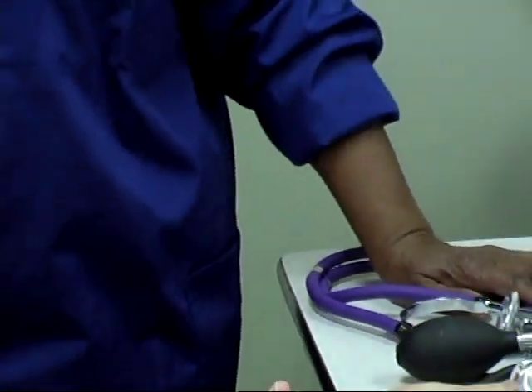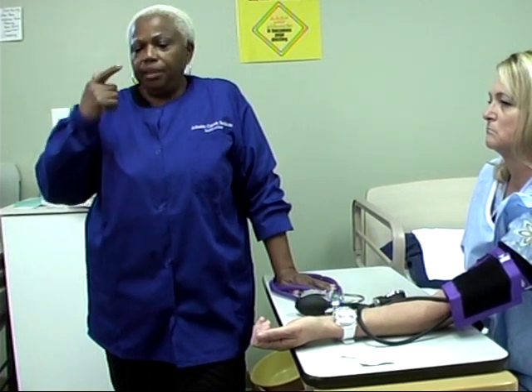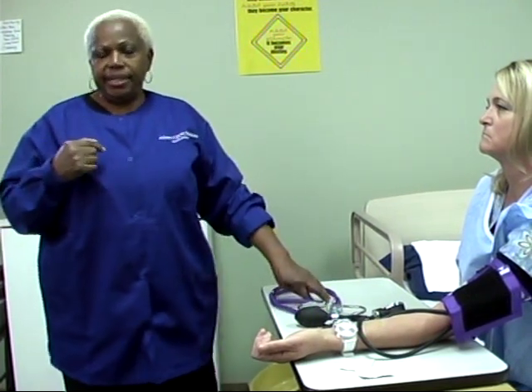The way you do this blood pressure: the first sound you hear that sounds like a heartbeat — whatever number it is at when you hear that beat — that would be your systolic number, your top number. You will hear beats continually until you don't hear them anymore. The last number at which you hear the beat would be your diastolic number, your bottom number.